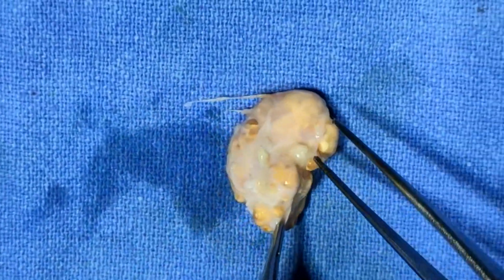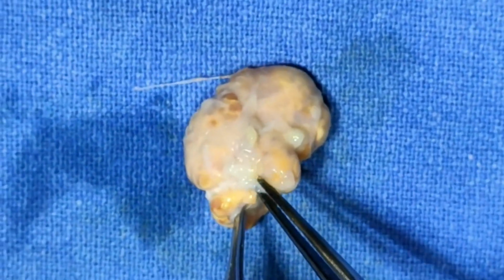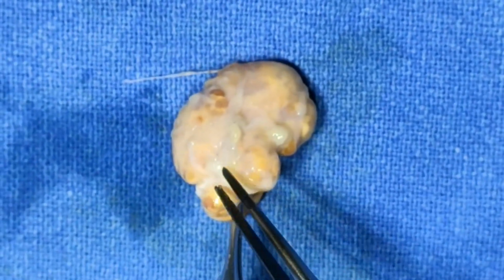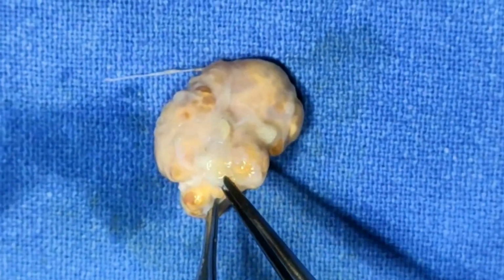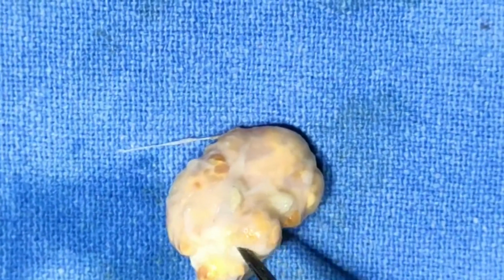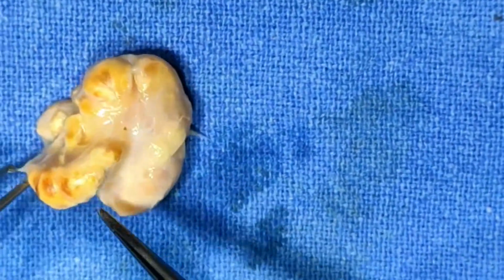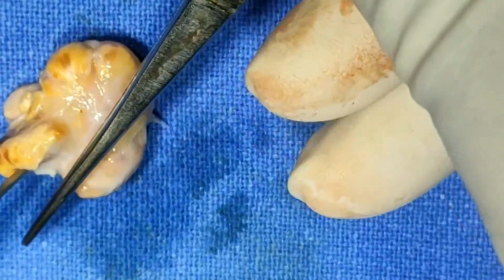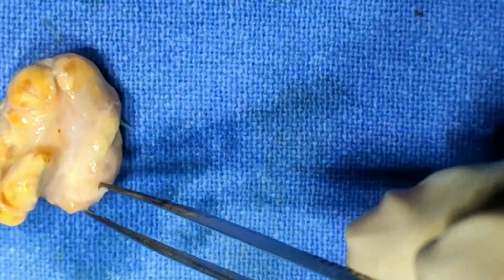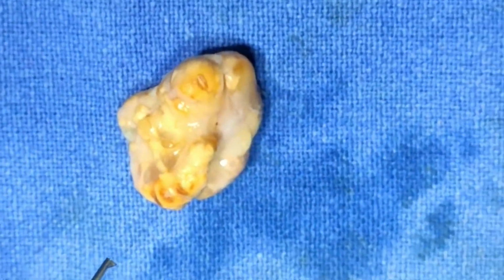Here you can notice the tissue was adherent. This hard tissue is the joint capsule, because it arises from the interphalangeal joint. This is very tough, and this is the part of the capsule I have removed, and the periosteum of the proximal phalanx was also peeled out. Now I am turning this specimen. Here you can notice this bar. See, this gutter is for the flexor tendon. So this deeper part was lying like this. For histopathology I am sending this.